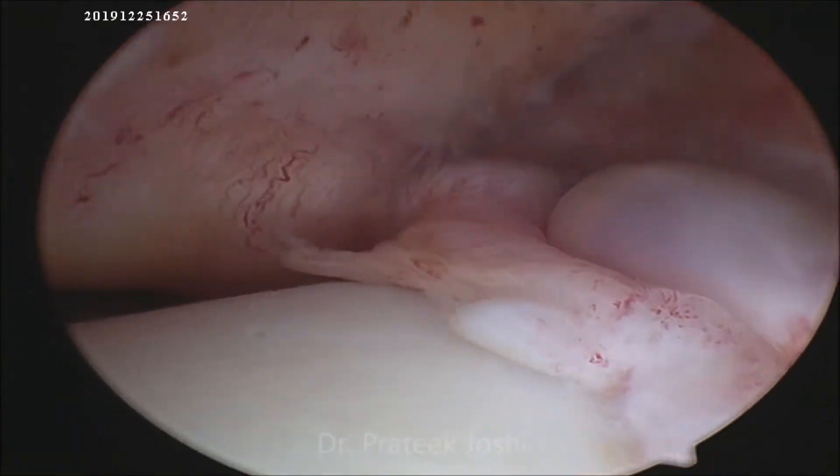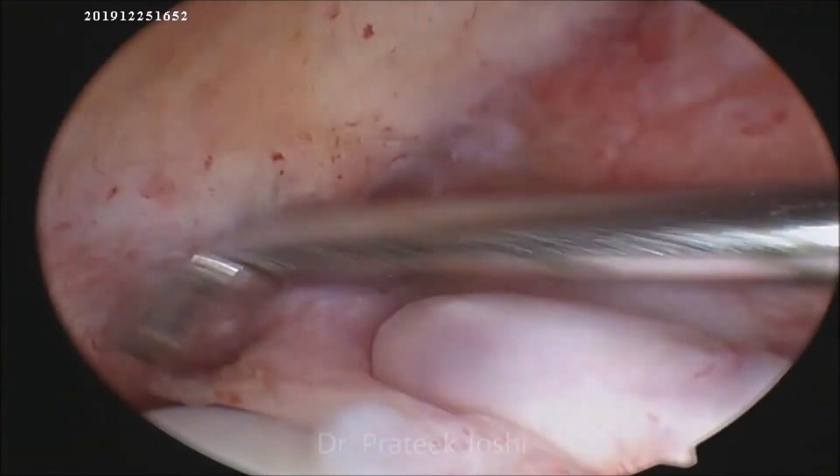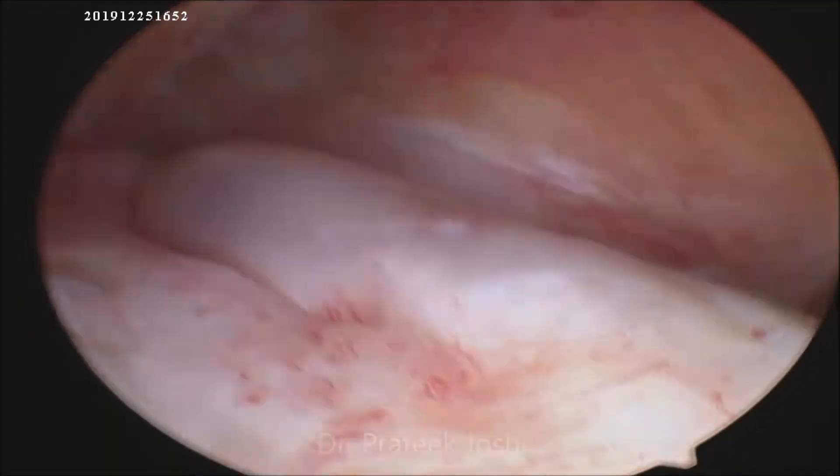Now as we go into the intercondylar notch, we see there is a complete tear of the ACL from its femoral attachment.